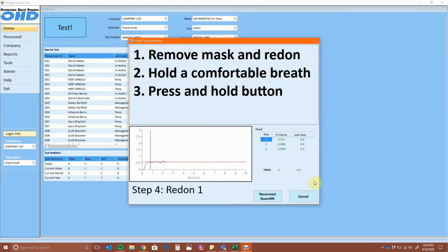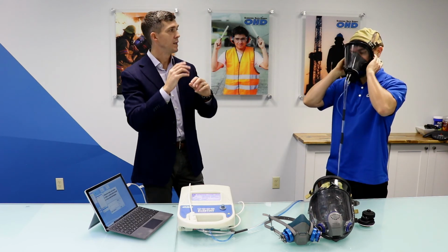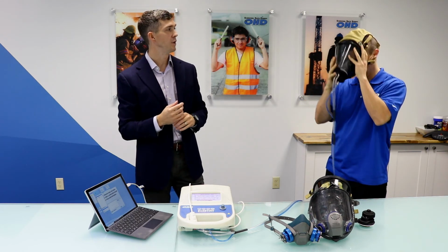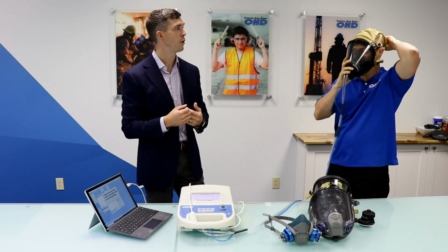So he can take as much time as he'd like to re-don this. Normally, people that are well trained, a few seconds, take the mask off, re-don it, and you're good to go. So another good score. So Stephen, one more time, if you'll loosen your straps, take the mask off your face just like you would at the end of a day of a shift or whatever. Now re-don it like you're putting it back on in the morning.